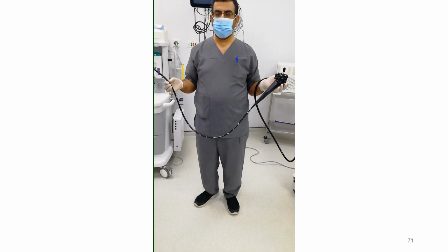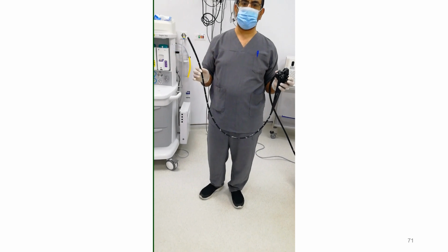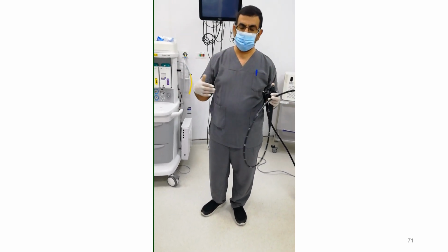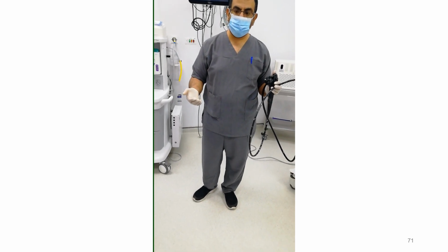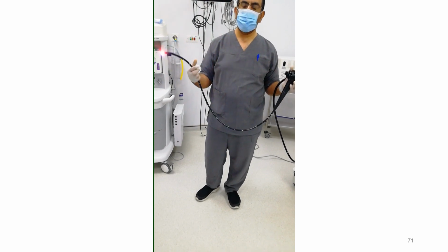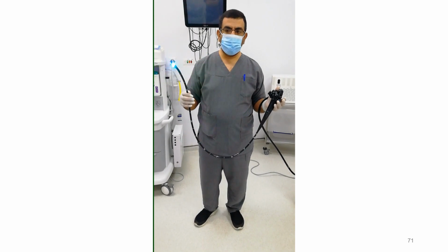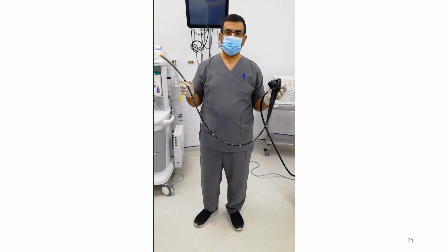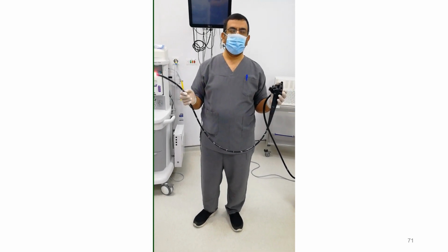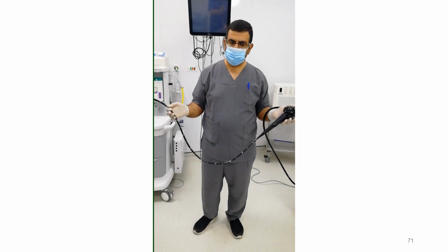في حاجات تانية بنعرفها من الخبرة، إزاي؟ في حاجة اسمها فيكسيشن للمنظار، إنك بتثبت المنظار بتاعك إزاي؟ ساعات وأنت بتحقن الفندس فيرسس بتلاقي المعدة بتكون كبيرة شوية، فكل ما تيجي تتحرك بالمنظار يمين وشمال خاصة لما المنظار يكون طري شوية فليكسبل ما بتعرفش تحقن كويس، خلاص كده اتفقنا؟ أو إن لو واحد عنده مثلا جاستريك أوبستراكشن المنظار بيعمل لوب، خلاص كده اتفقنا؟ أو في بعض حالات الأيليوسيكال أو في الكولون. طب بثبت المنظار بتاعي إزاي؟ ولا حاجة.